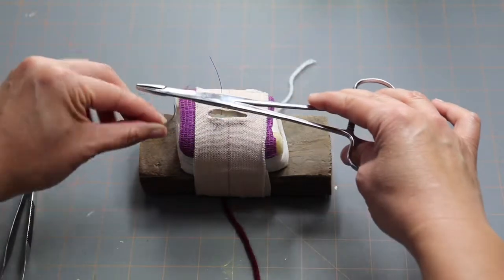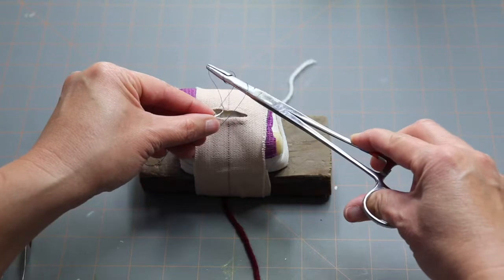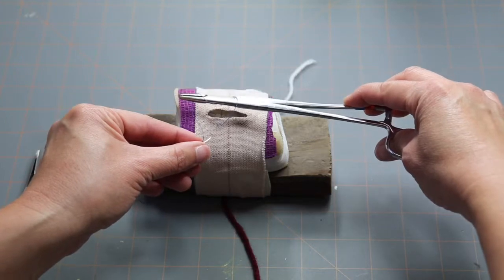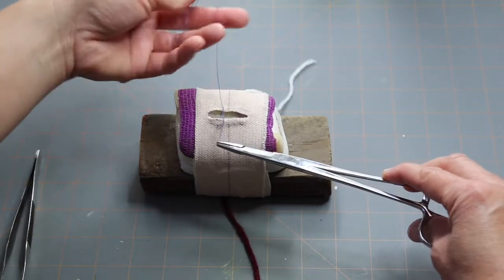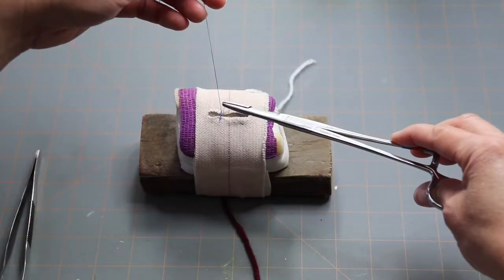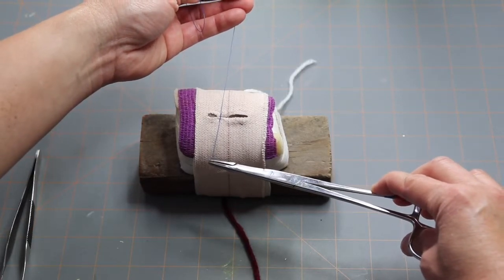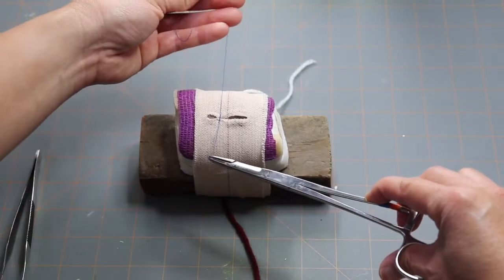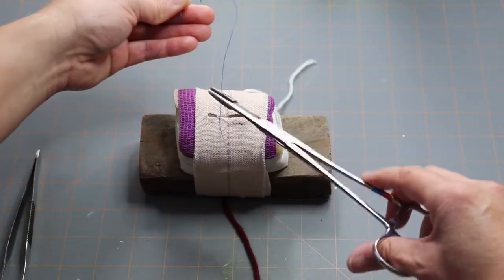For the first throw, wrap the suture around twice — over and around once, twice — then grab the end of the suture. Pull your hands in opposite directions: left hand goes away from you, right hand goes towards you. Keep your suture parallel to your patient — don't pull it up in a V, you want it flat. Just oppose the edges; don't pull it too taut where the skin is puckering because that's going to hurt the animal. Pull taut just until the edges of the incision are opposed. That's throw number one.